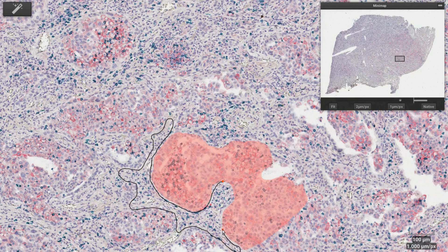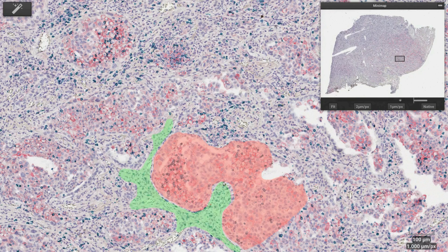Using just these regions, we will achieve an estimated accuracy for the cell classification across the entire slide of 84%.